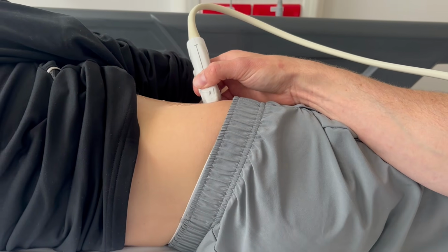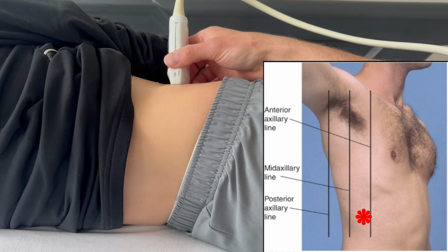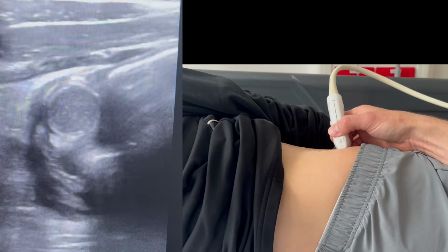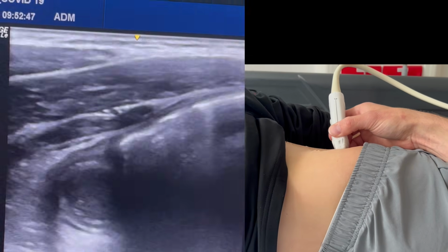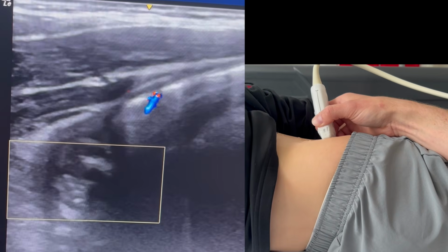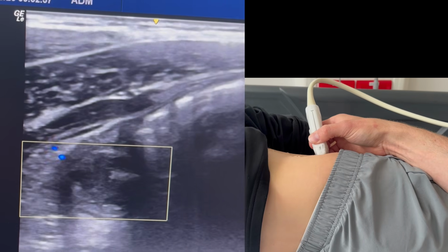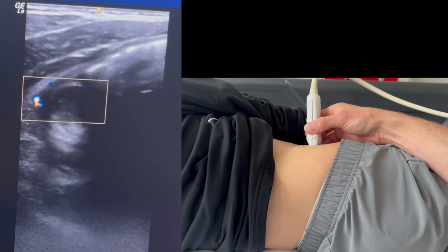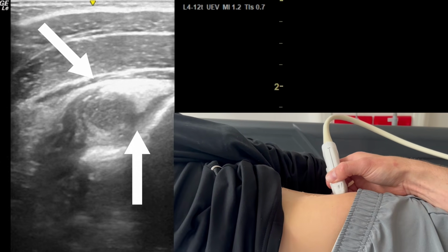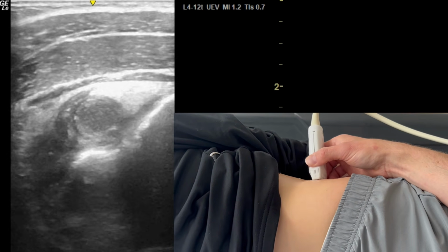So this was the patient I had, and his family were excellent and allowed us to use this video for educational purposes. He had pain in a very unusual place, pointing just there above the iliac crest with a red star. And excuse the poor images, we're getting this in real time on our mobile phone just to show, as we're scanning, the appearances that we found in this unusual position with the patient turned onto the left. We can see there we've got increased colour Doppler pickup, significant inflammatory fat wrapping, as you can see here on the proper image. And visualising this anteriorly with the patient supine, we just couldn't identify this.